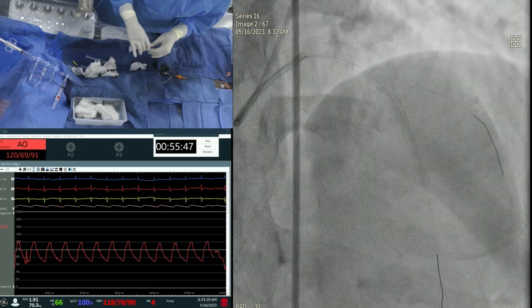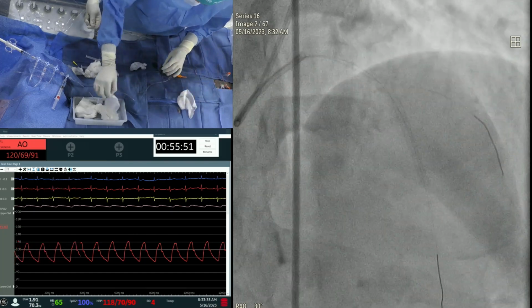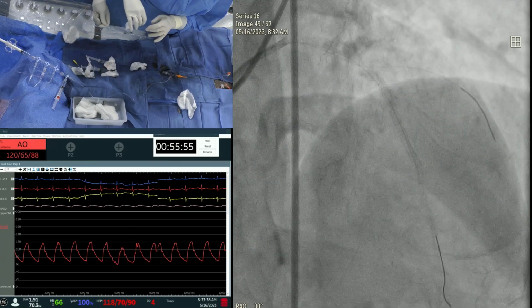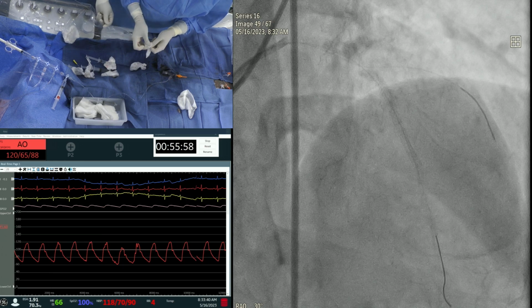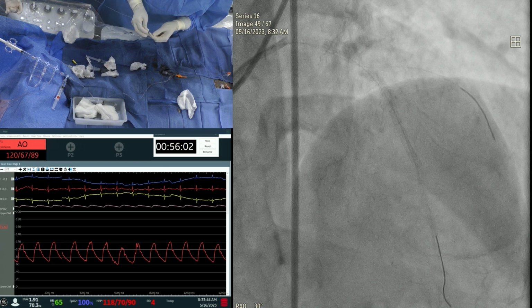In our lab, it will be 75-80% mini crush for the two-stent technique, about 10-15% DK crush, and then a little bit of TAP or step crush or reverse crush if they're radial and 6 French. Very rarely we do culotte.